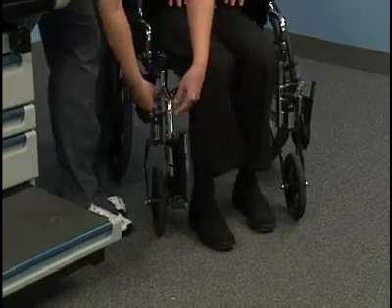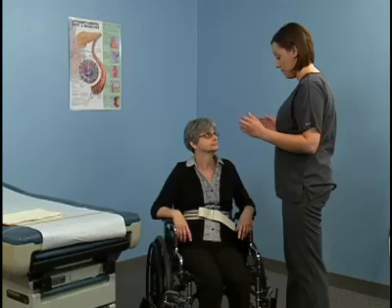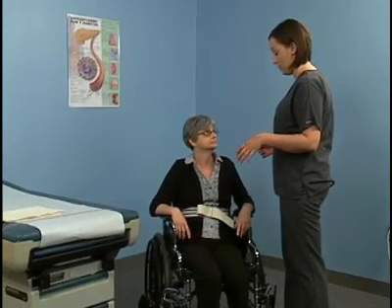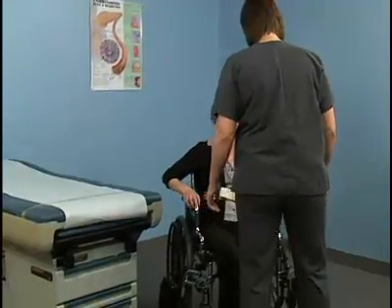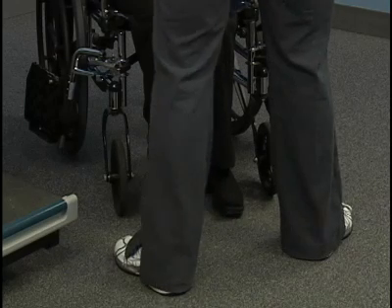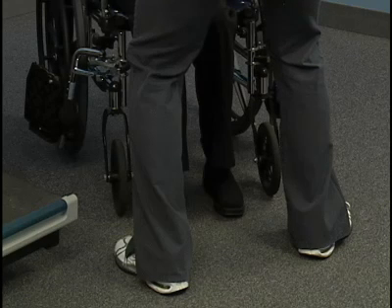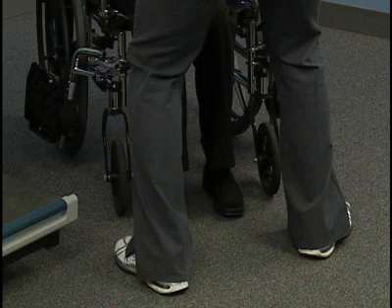Make sure the patient's feet are positioned flat on the floor. Tell the patient what to do during the transfer. Stand in front of the patient with your feet about 6 to 8 inches apart with one slightly forward. Point the toes outward and bend the knees slightly. This position provides a wide base of support for the transfer.